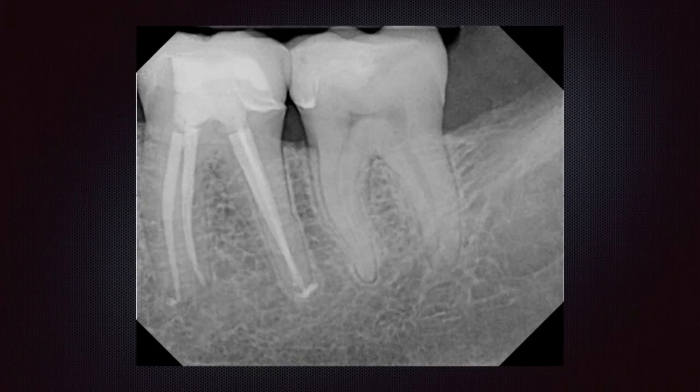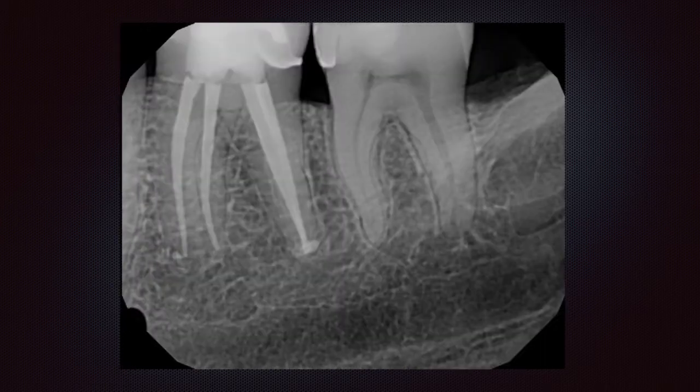Okay, so let's take a quick look at this tooth that I treated using the ESX protocol, the advanced protocol. This is a second molar, mandibular second molar, tooth number 18. And it's interesting because this very same patient I treated myself 4 years ago, the tooth in front of it, tooth number 19, the mandibular first molar, using the EndoSequence and the BioCeramic sealer using the Bonded Obturation.